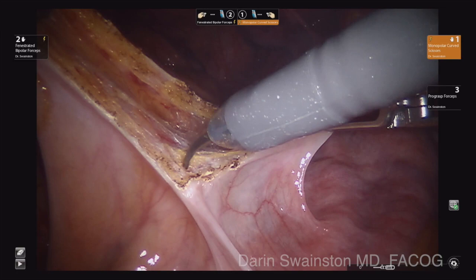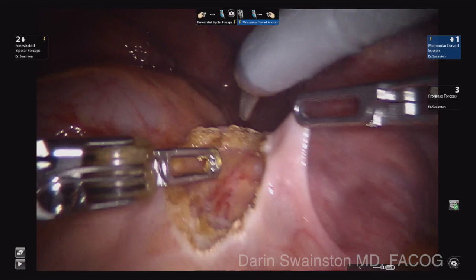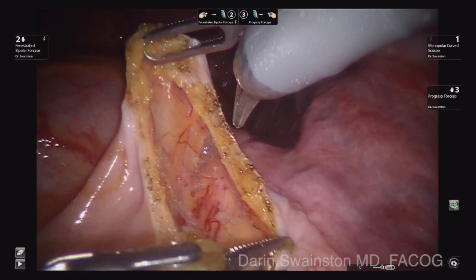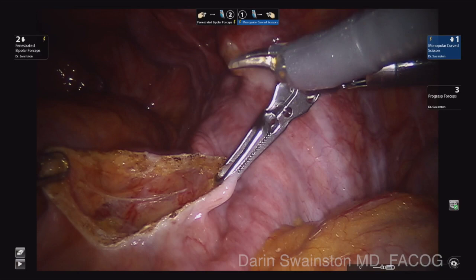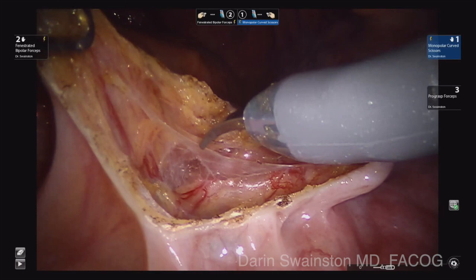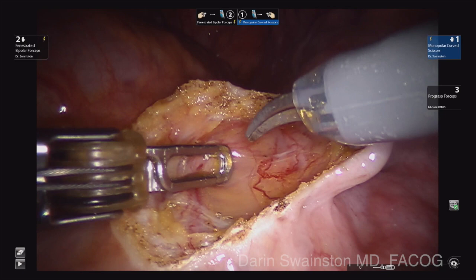It is important to try to open this area up as wide as possible so you can easily see the area you want to operate. One helpful technique is to gently tap over this area. If you get a really big trampoline effect — where you touch the area and get a lot of bounce — that suggests there are large vessels underneath that you must be careful of, or increased fat over the sacrum. It is just really important to be careful where and how rapidly you dissect here.